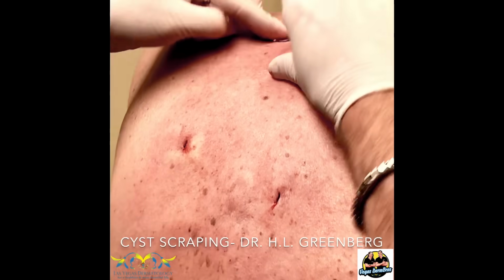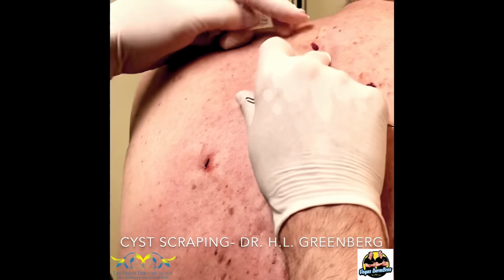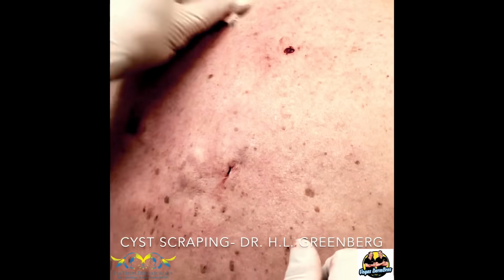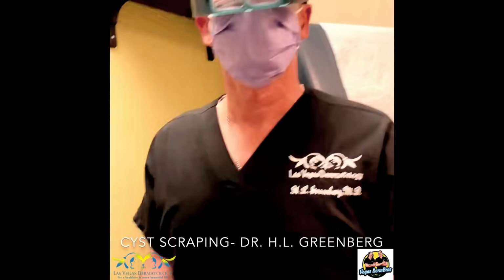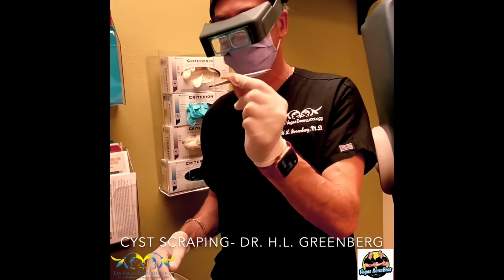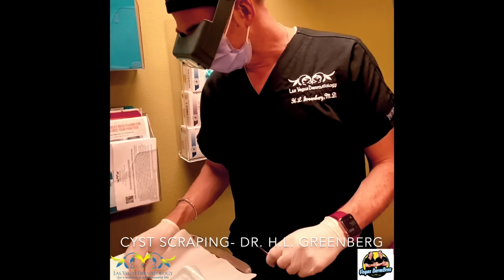Let's take a look here. So, Dad, you got to use this. Mom has 2 of them in her bathroom. It's like that long plastic handle, and it has the poof thing at the end. All right, and you can use that, like, over your shoulder to clean your back. I used this in my cyst removal, I&D, with an 11 blade. Here's the 11 blade.